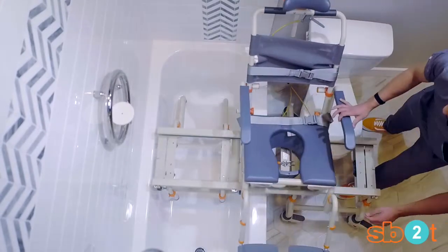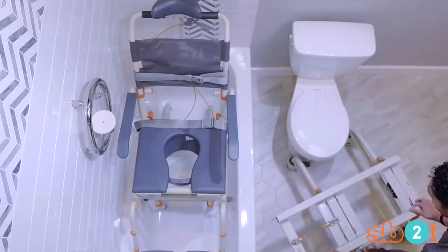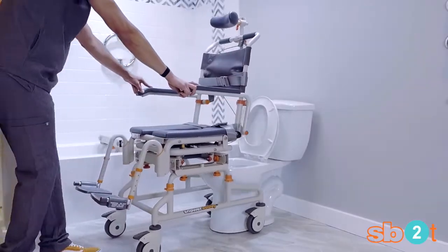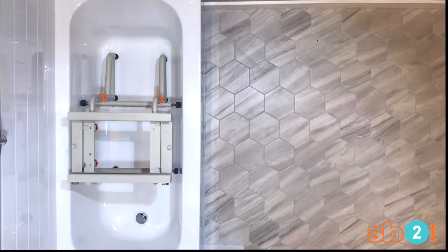Tool this installation in minutes, allowing you to bathe same day. This solution reduces multiple transfers, allowing users to use it as a bedside commode, over the toilet commode, and bathtub transfer system.